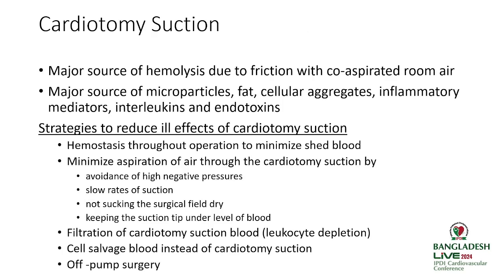Okay, so after that, I need to tell you what we do in cardiotomy. We do cardiotomy suction. I have seen assistants continuously shouting at the perfusionist, blue up, red up, blue up, red up. But always remember, cardiotomy suction at high negative pressures isn't good, because you're creating an air-blood interface, and if you suck too heavily on that, you're going to hemolyze this blood.